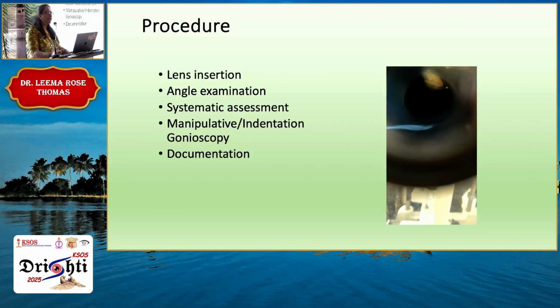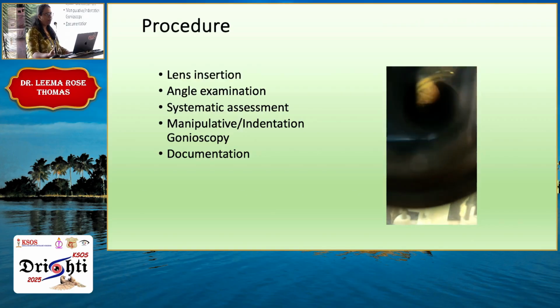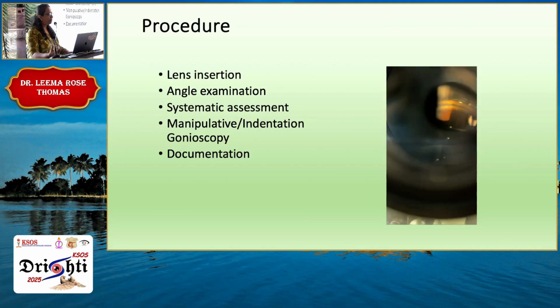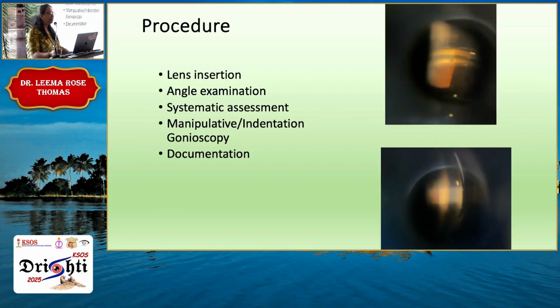you focus on the angle. Usually the inferior angle is looked at with the superior mirror, and you focus on this to look at the different things. A systematic examination is required, and as you know, each angle is looked at.